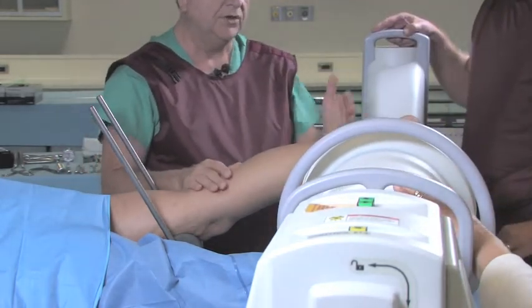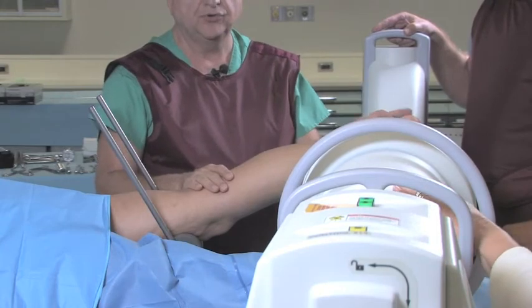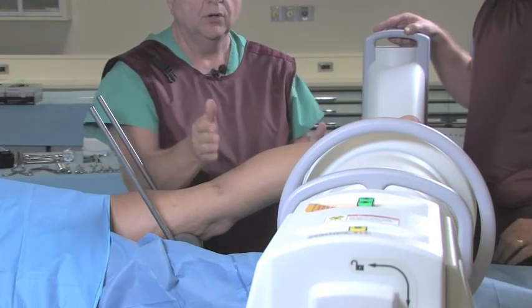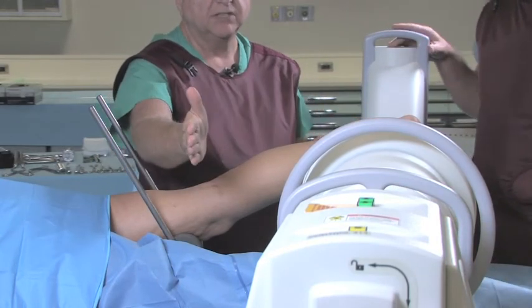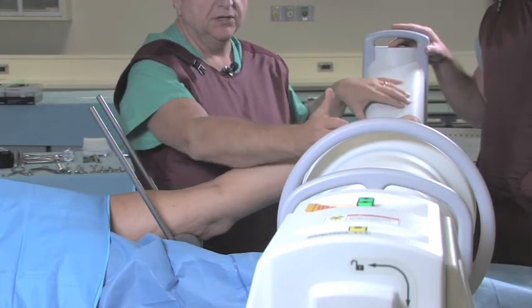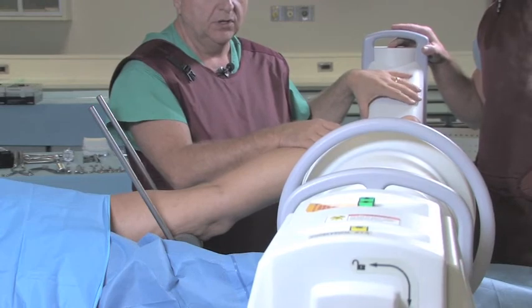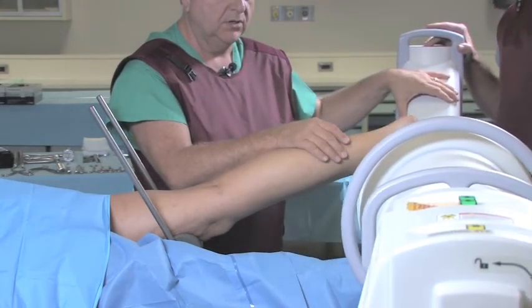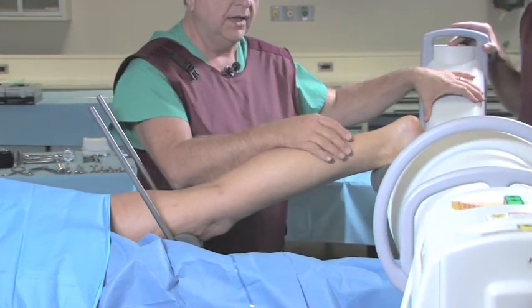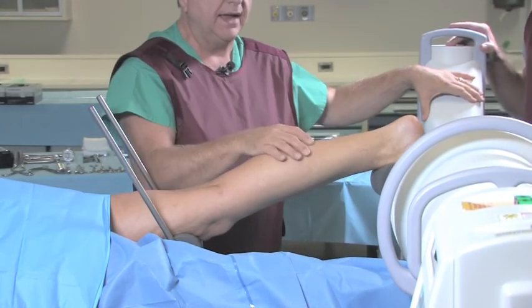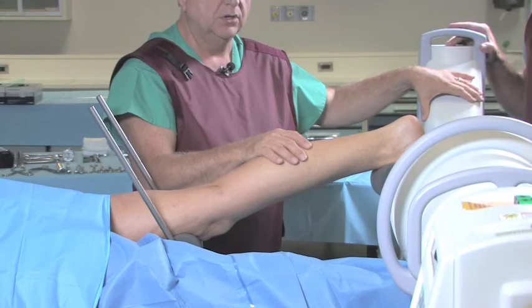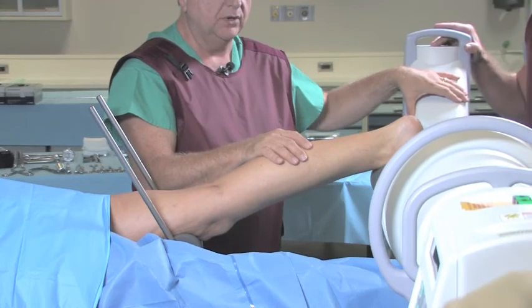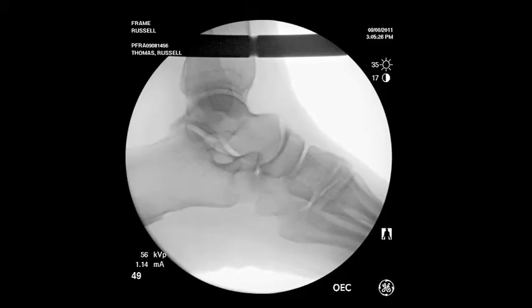And then to get a true lateral, we'll move the base of the machine distal, and then swivel back into a true lateral x-ray.